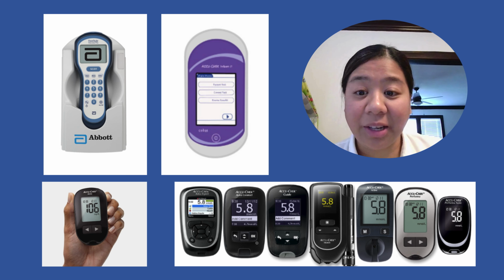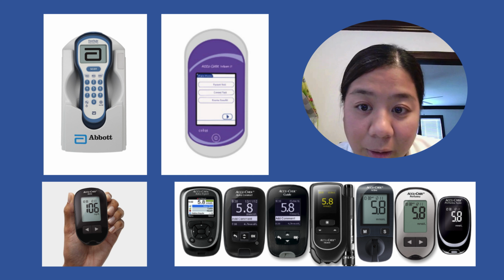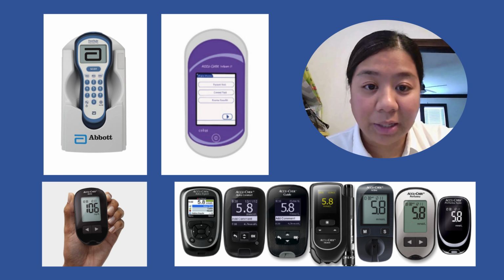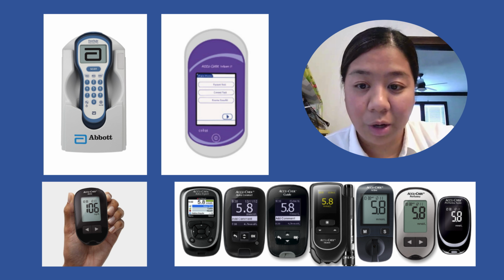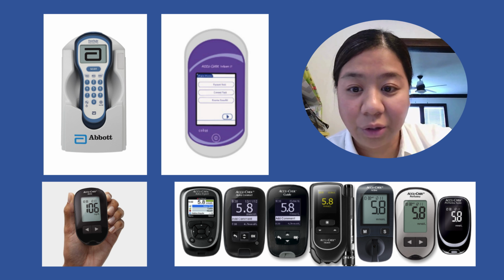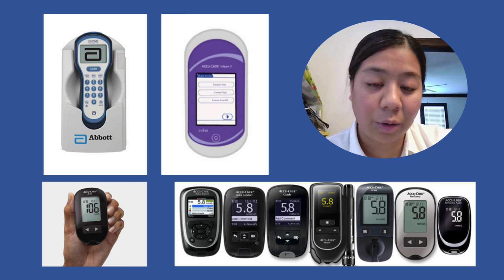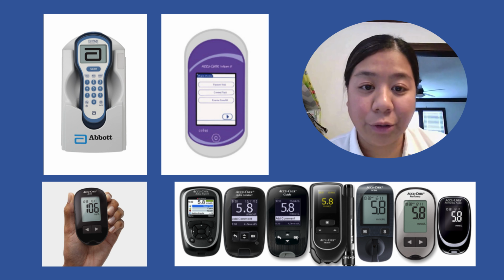As I've previously mentioned, here are the examples of the glucometers that we are using in the hospital and other facilities. The first two glucometers you are seeing on your screen right now, the Abbott and the Accu-Chek, are the common glucometer brands that we use in the hospital. These are big ones. The one below, the Aviva, is the one that I've shown you that I have at home, and then the rest are commercial ones that can be used at home or for personal use.